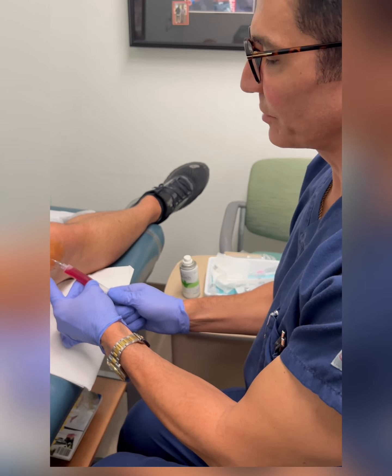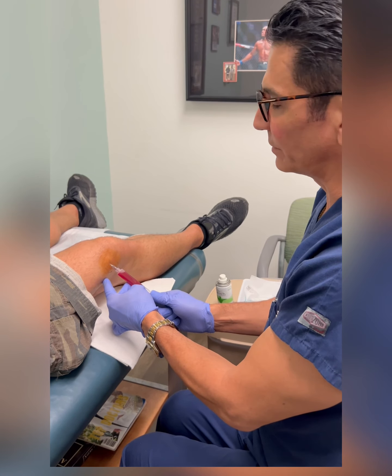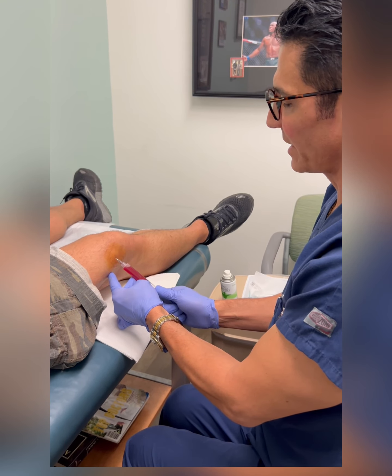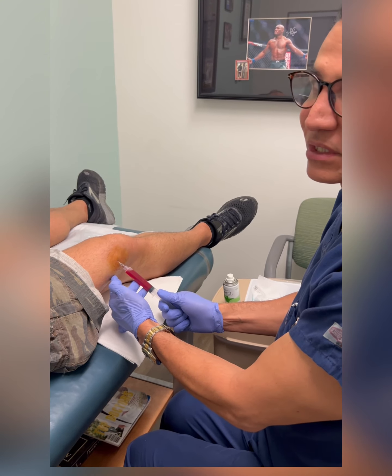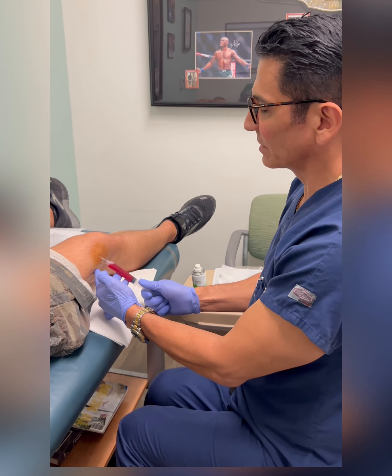Knee aspirations don't need to hurt. Just let the patients know they should be comfortable — that way they're nice and relaxed. In this case the patient is lying down, nice and relaxed. If you do it right, it won't hurt. Hopefully that demonstration is helpful, and more importantly, helpful for your next patient.